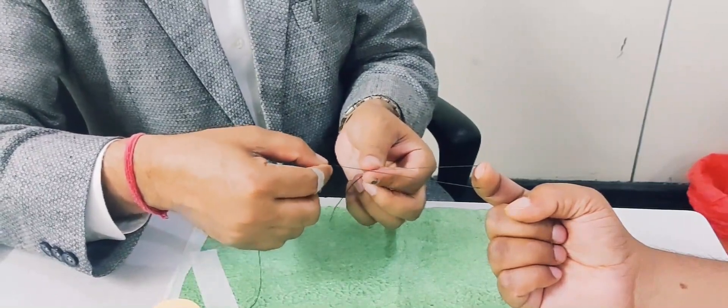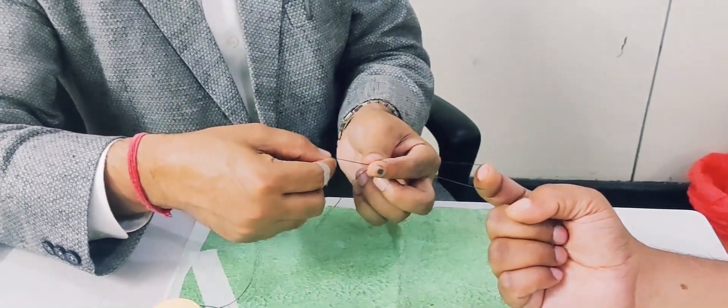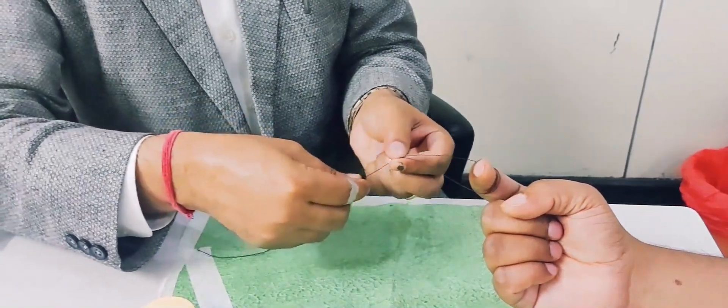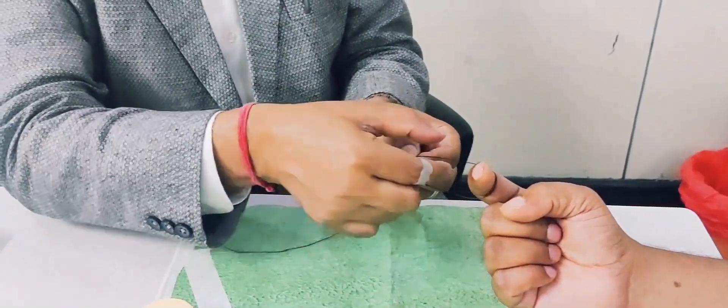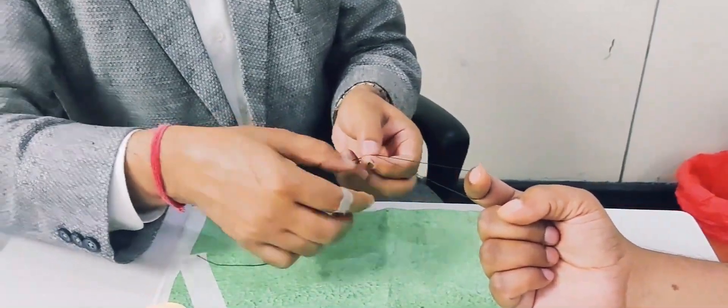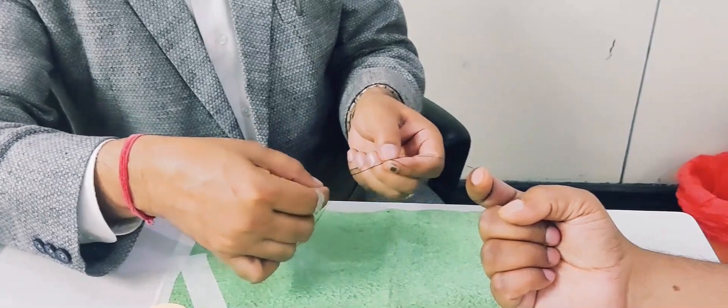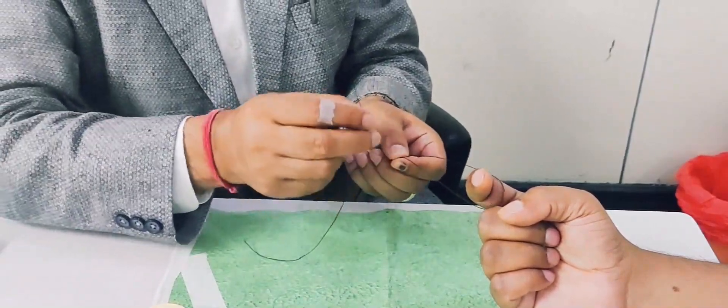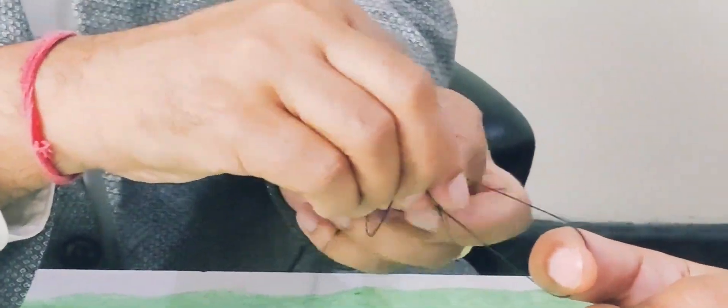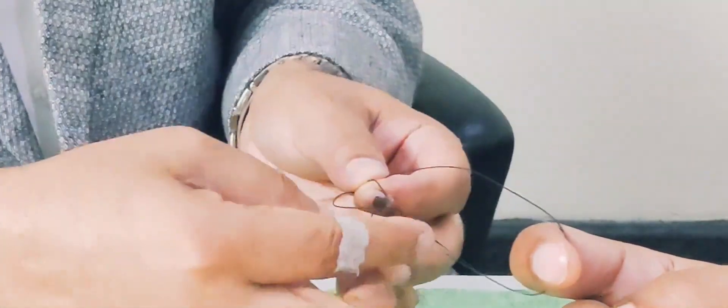Now you go there, you hold both threads together, and then from here you have now two arms. This is the right arm or this is the left arm, you can see. So what I will do is you take this thread and you will do one half loop. Can you see this? This is one half loop.